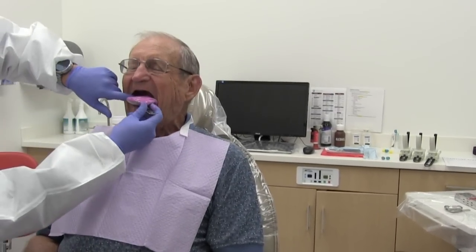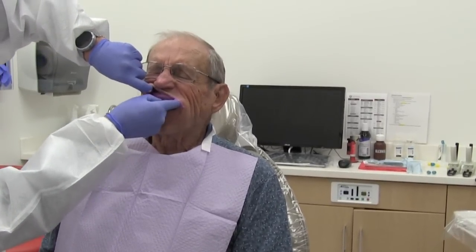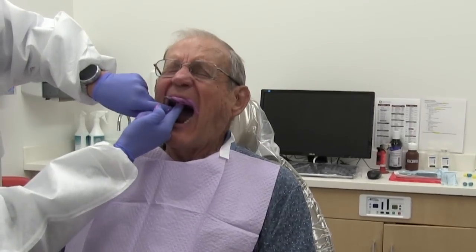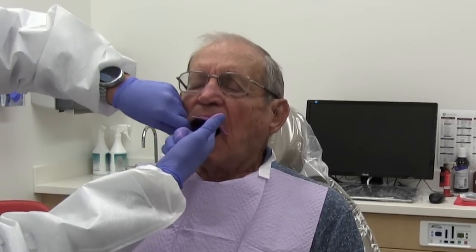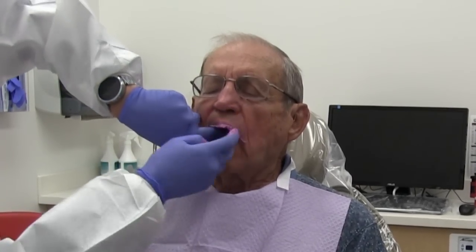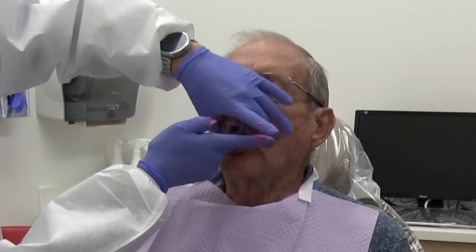Patients will usually tense up — look how tight those muscles are. You'll never get the material in there, barely get the air out. So I've lifted up to let all the air out and I'm wiping on either side, wiping on the premaxilla, smearing it so I have the best chance of wetting the entire surface. Open wide — that displaces the coronoid process forward. Close into the middle, giving us more range of motion. Forward and back — that moves more of the coronoid process. Tonsillar pillars around — now we're shaping the buccal frenums, vestibules, labial frenum, vestibules, the fornix area. All of that is now being captured arbitrarily within one minute while this is setting.